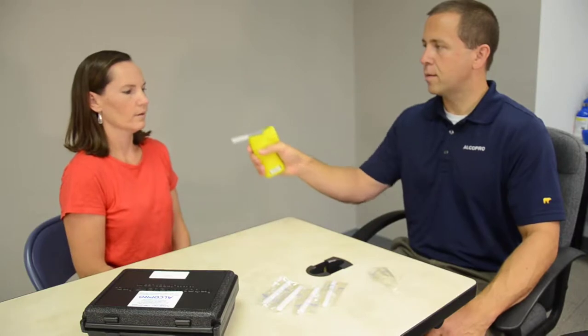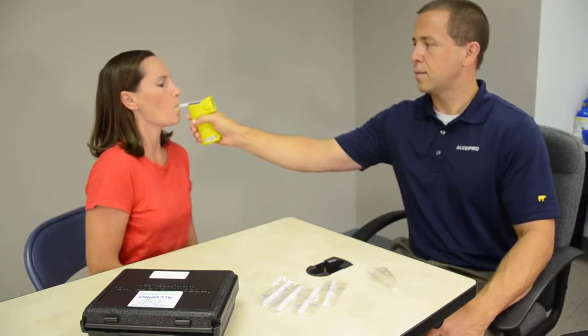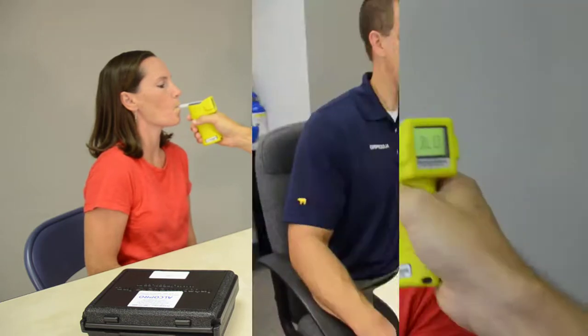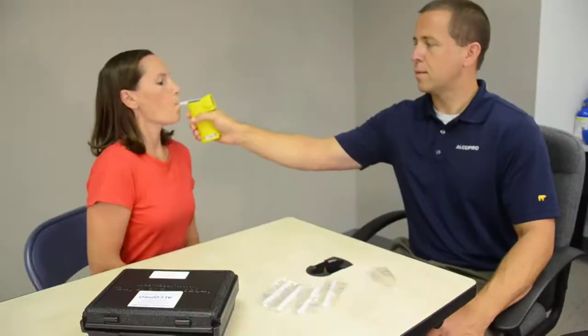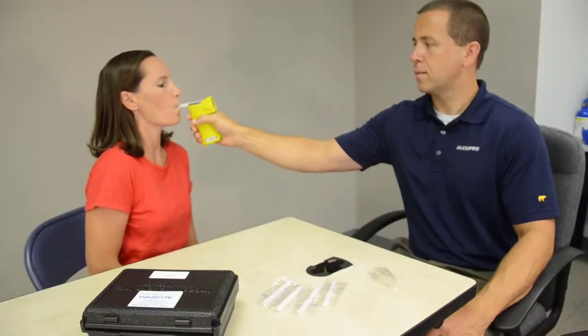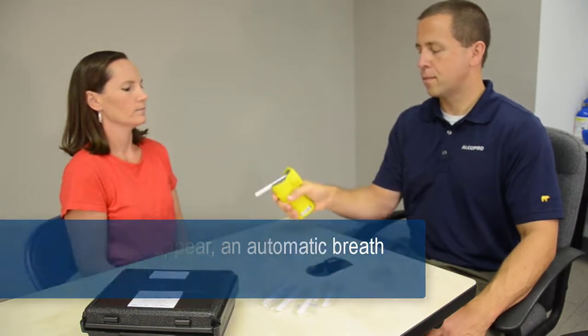Instruct your subject on the proper procedure for providing a breath sample. As the subject provides a deep lung breath sample, the icon of the head stops flashing, and a dash appears to the right of the head, indicating the device senses a sufficient breath flow. Once three dashes appear, an automatic breath sample is taken.